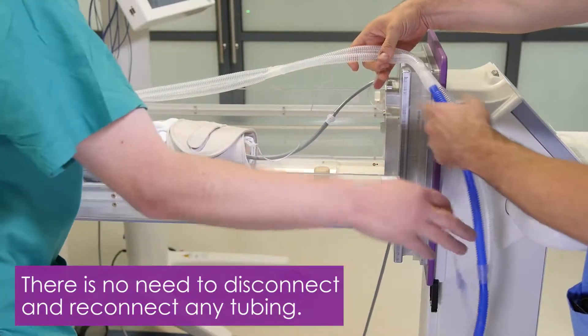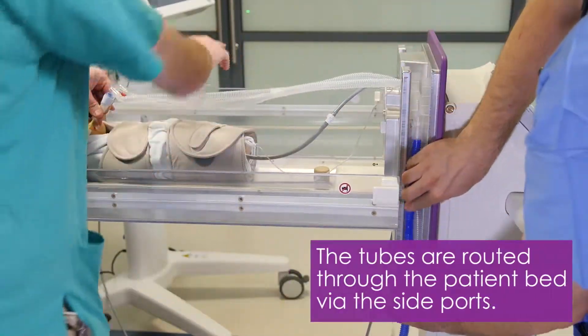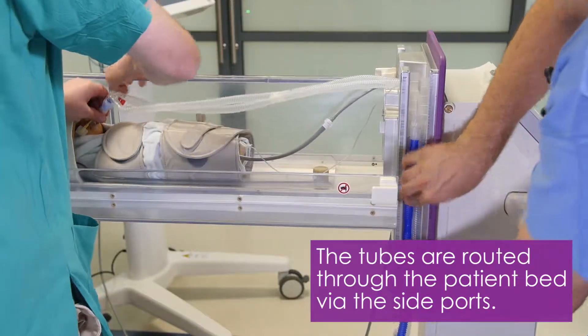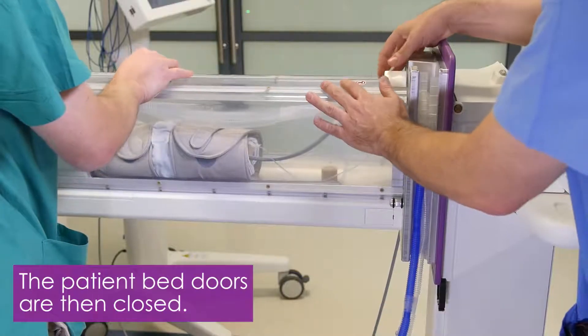There is no need to disconnect and reconnect any tubing. The tubes are routed through the capsule via the side ports. The neonatal capsule doors are then closed.